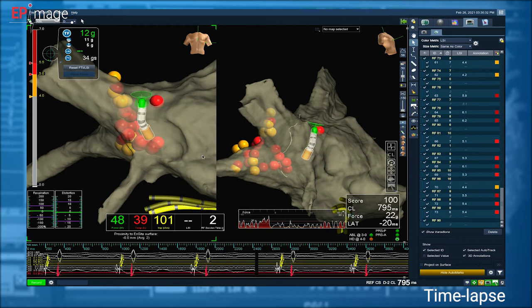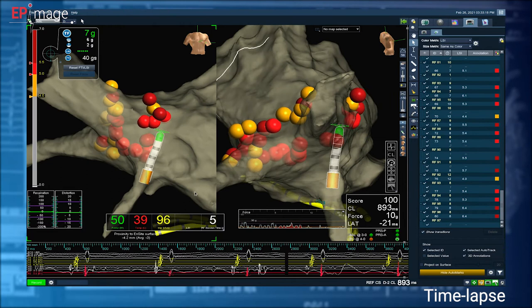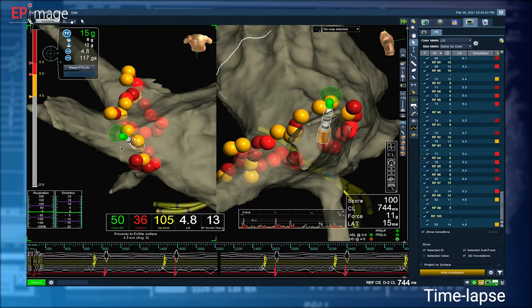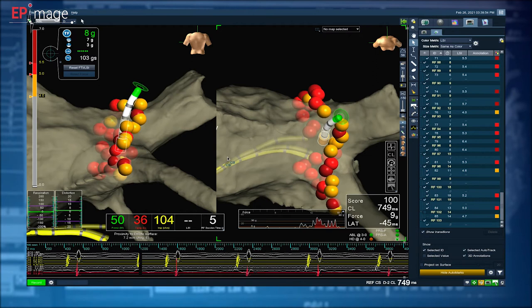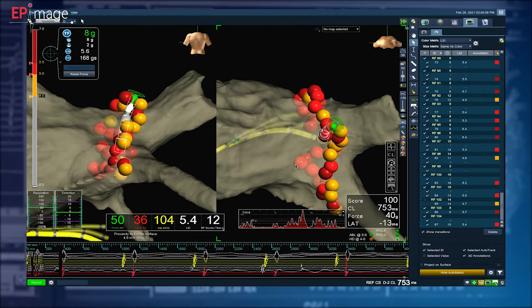In this superior aspect of right superior pulmonary veins, you know that sometimes it's quite a thick portion of myocardial tissue, because that's the region where Bachmann's bundle connects. So in some cases you have to give extra energy or extra applications in this region. I have two approaches. First of all, I just ablate and look at LSI, or I ablate during pacing, just to be sure that I have burned through the tissue and I have no more effective capture of my pacing from the ablation catheter.